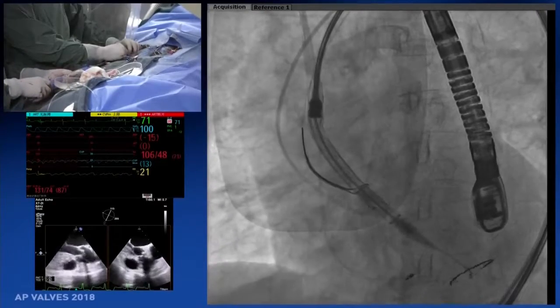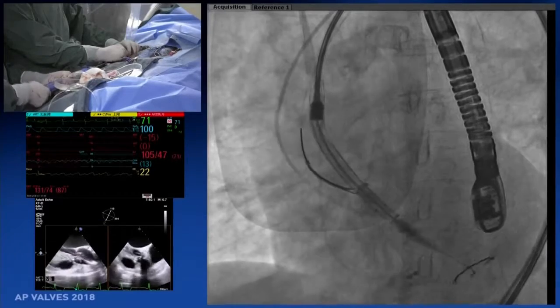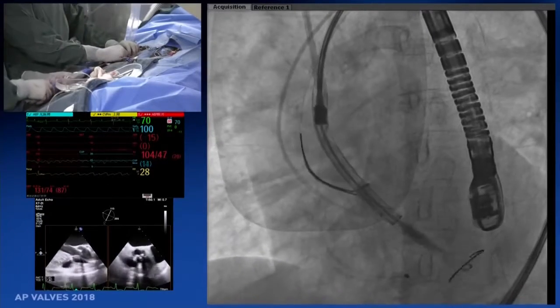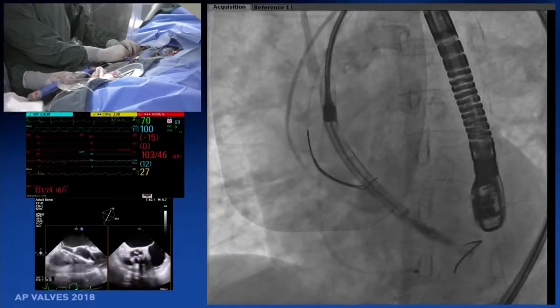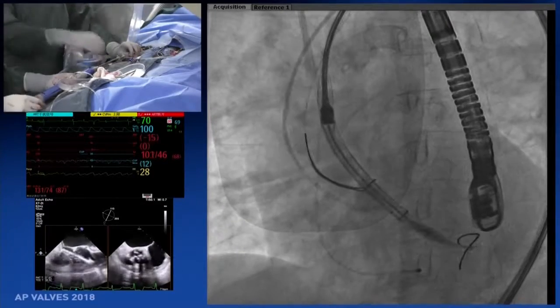And the device is already in the left ventricle, in the middle of the left ventricle, absolutely deeper. By the way, this time we don't want it too shallow. Go on. But if you now pull a little bit on the snare, then you will be more coaxial. You think? Yeah. Wait, snare.